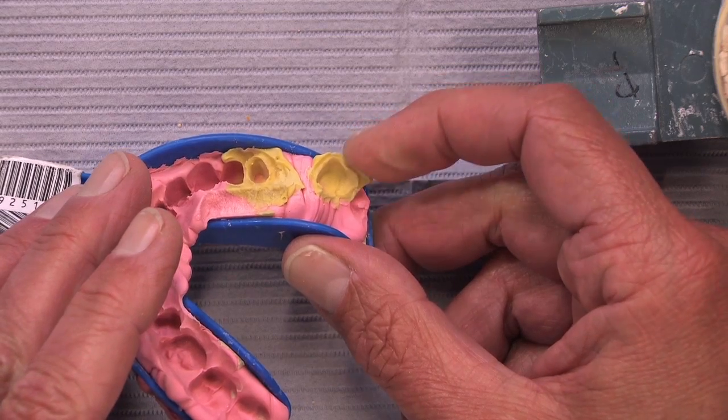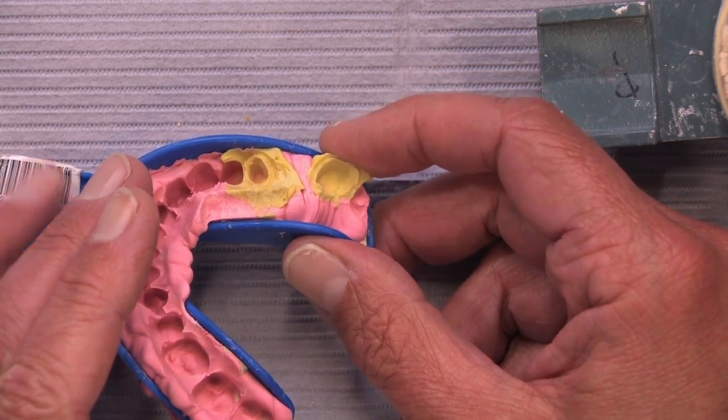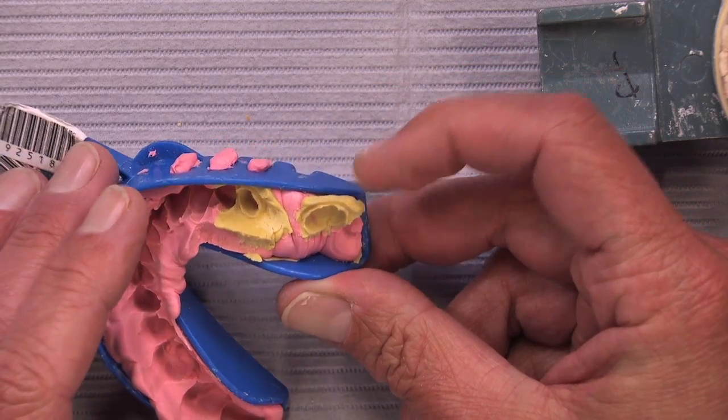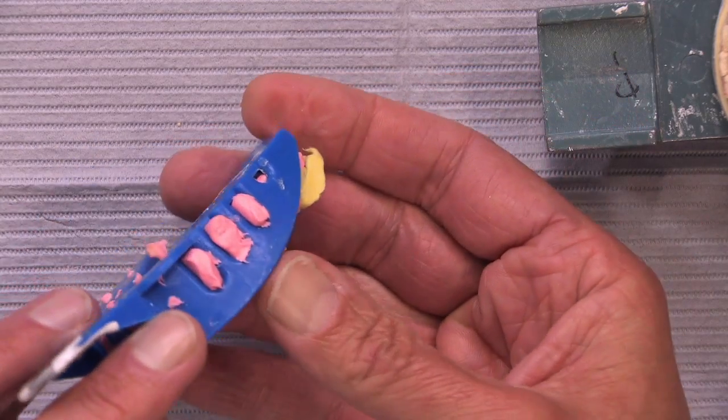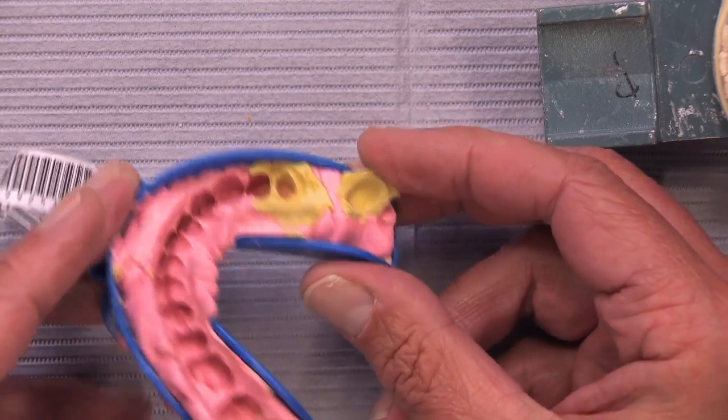But you can also see that without that material supporting it on the outside, it'd be pretty easy to get some sort of deformation here where it may not fit. I mean, technically, this is actually almost kind of outside of the tray itself when you look at this impression.